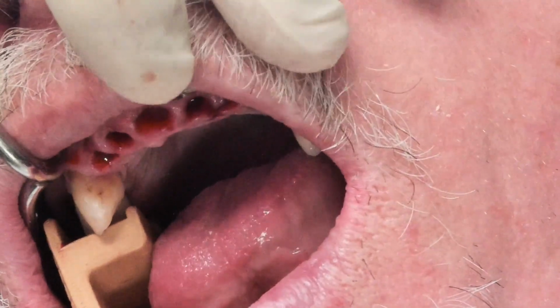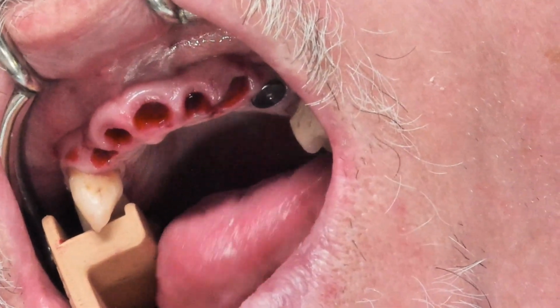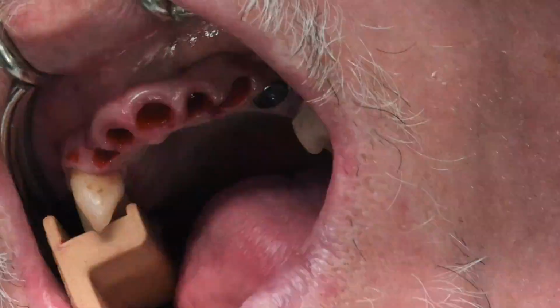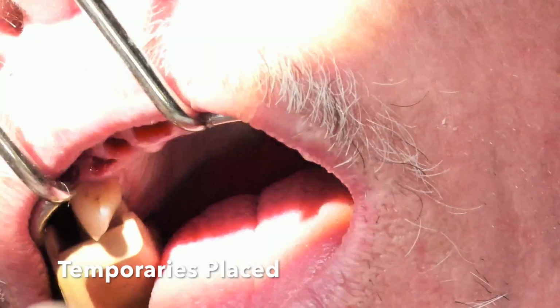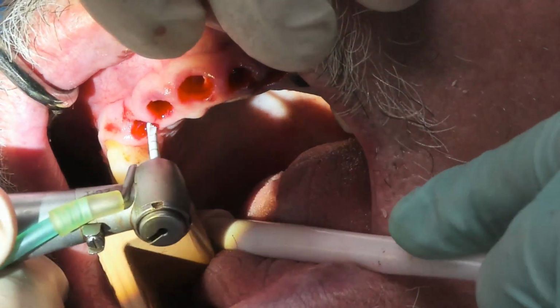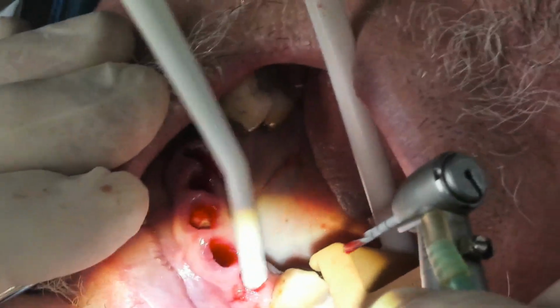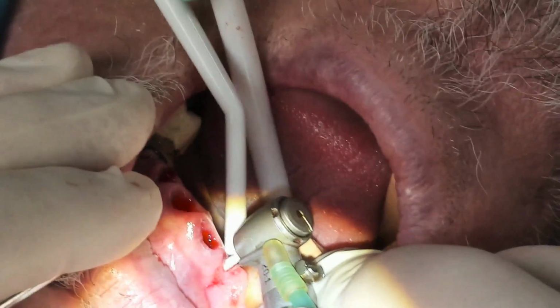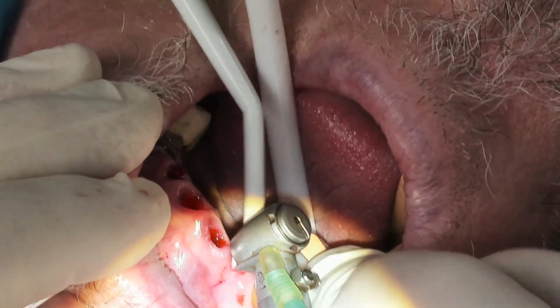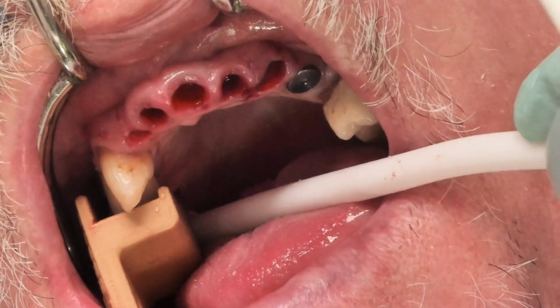Okay, so let's get to the kit now for a second. I'm going to try to do it without the extension, but we'll see. All right, so we're going to start our site preparation and coring. Suction right here, Ina, for me, and I need the smaller tip. I need to see right in here, please. So what we're doing for Alan is just going with our coring site. I'm going to have to go to the extension.